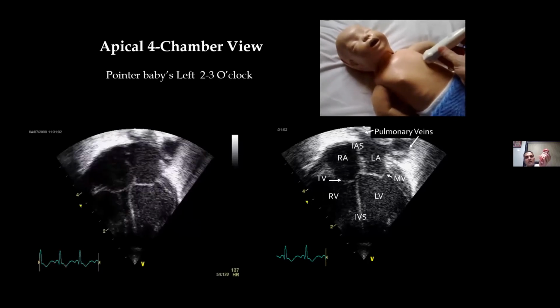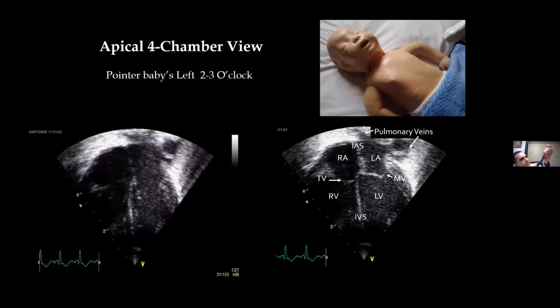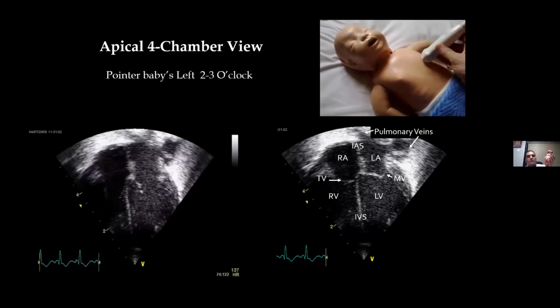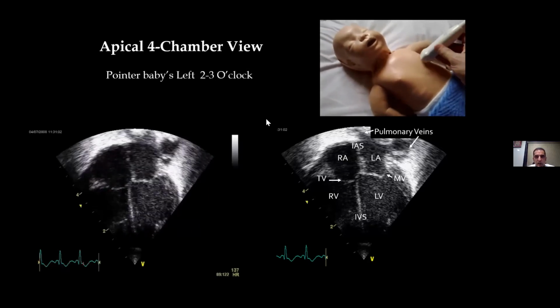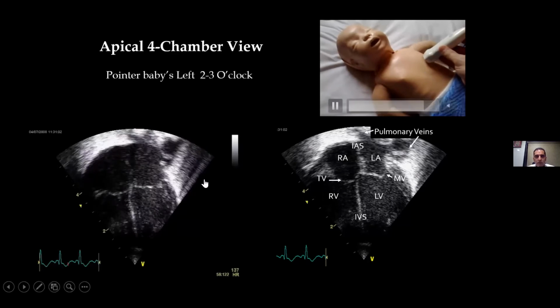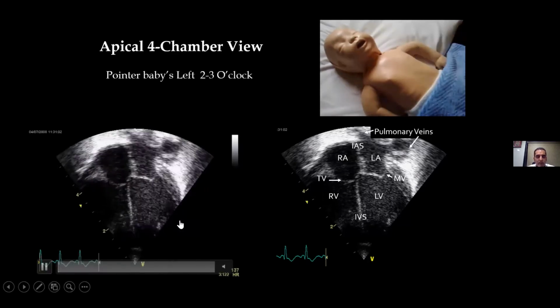This is your heart, okay, and this is how I'm seeing it. So that's how the heart is being cut. So ventricles are down and atria are up. So that's how you put the probe, and this is what you will see in upright section.